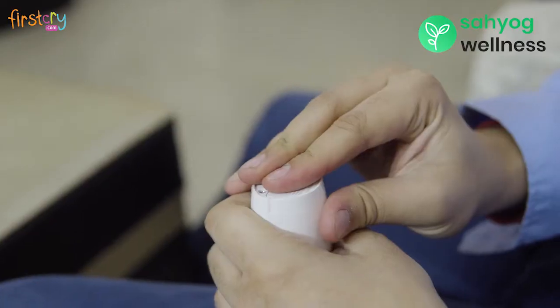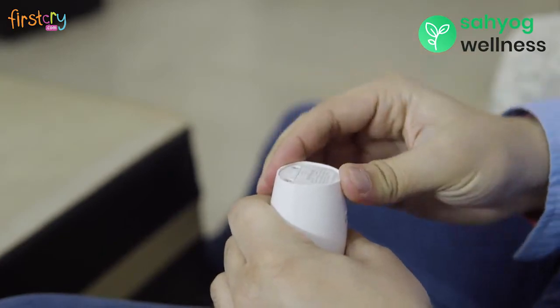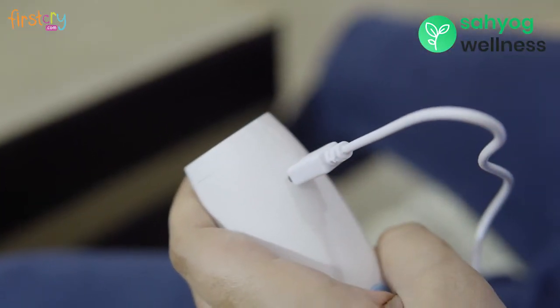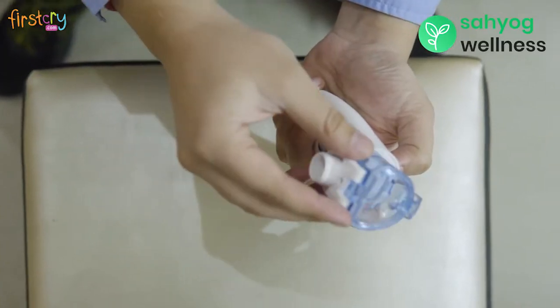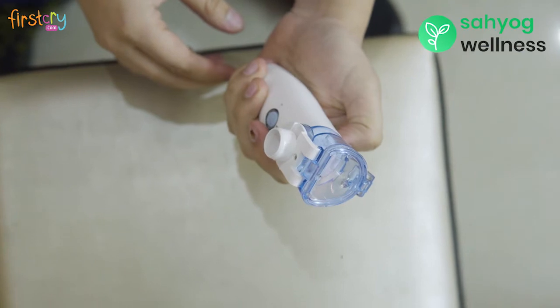To get started, put 2 AA batteries in the battery compartment, or you can also use a USB cable to use the nebulizer directly with a power bank or a power socket. Mount the medicine chamber onto the main unit until you hear the sound of a click.